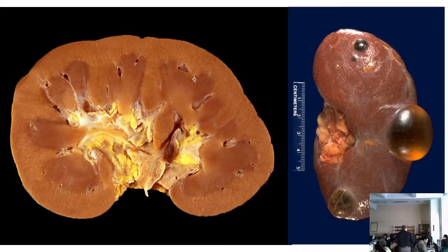If we have complex architecture, we have to judge the blood supply. Why? Because most renal cell carcinomas have increased blood supply, so this will raise suspicions of cancer in conjunction with the complex architectures with septa dividing the interior of the cysts. These are signs of malignancy.